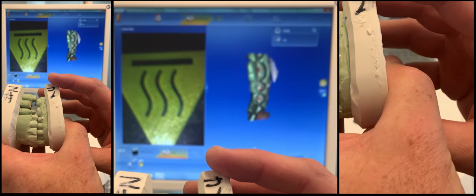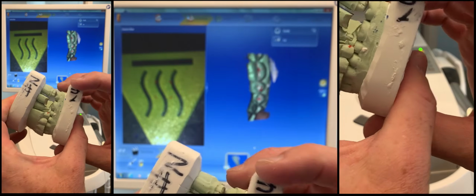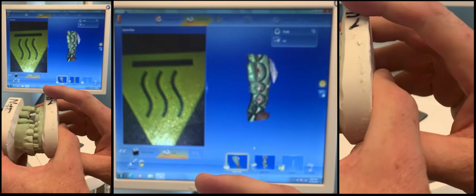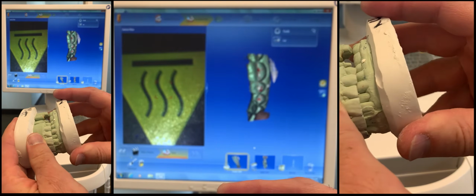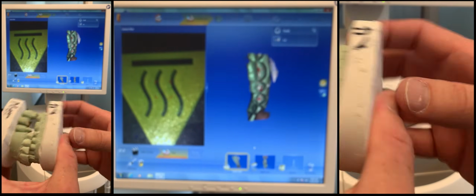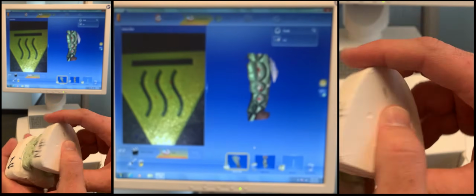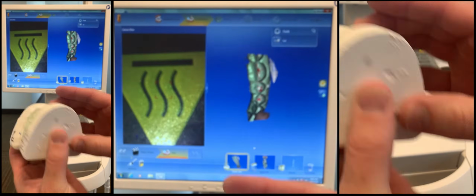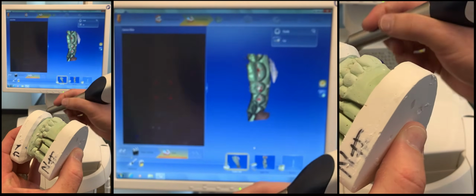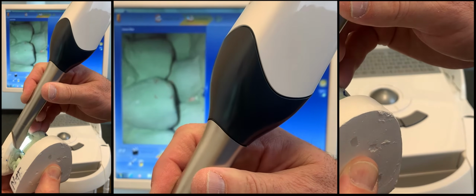So make sure that they bite correctly, and sometimes it's worthwhile to have the buccal scan done before they're numbed so that you can make sure they're biting correctly. But you have to guide them and direct them a little bit. Make sure you bite in your normal bite position with both sides together at the same time. Anyway, so let's talk about this buccal scan image. So again, make sure they're biting normally, and the patient would be laying like this. I'll lean it over here so you can see a little better. Make sure your camera's active, and then again, you want a fulcrum. I'm going to position it.